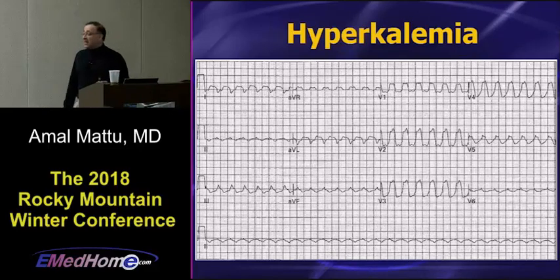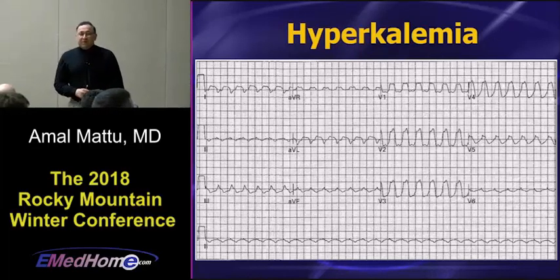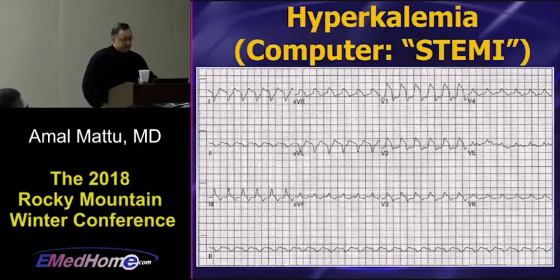This case had cath lab activation, and cardiology took a look at it and said, no, this is not a STEMI, it's rightward axis. They said, STEMIs don't do this. Just try some calcium and bicarb. So before the patient went to the cath lab, calcium, bicarb, boom, patient went right back to sinus, all right?